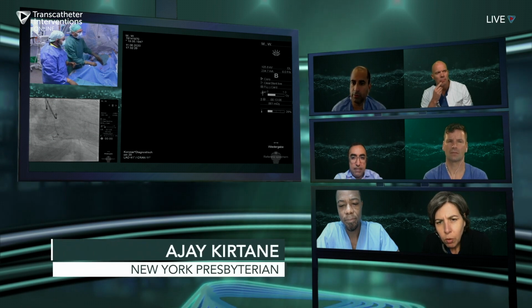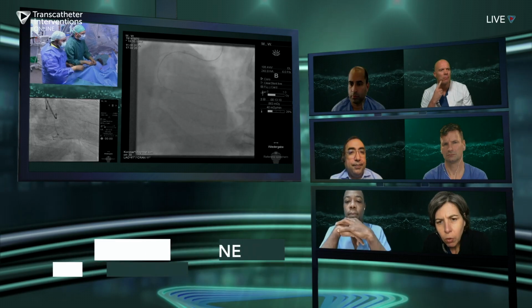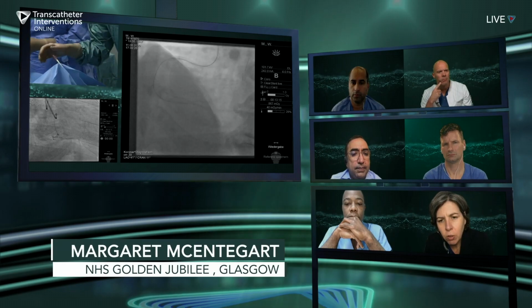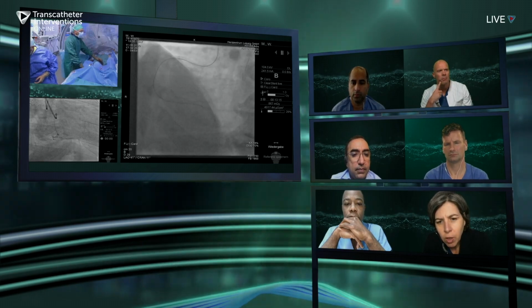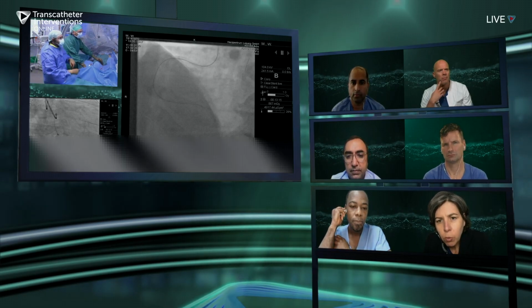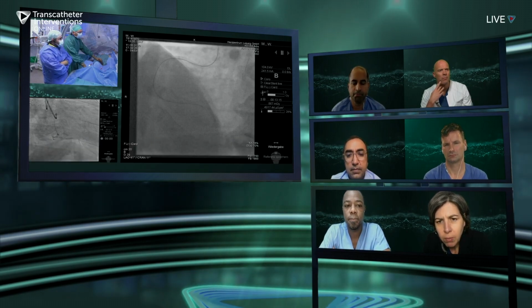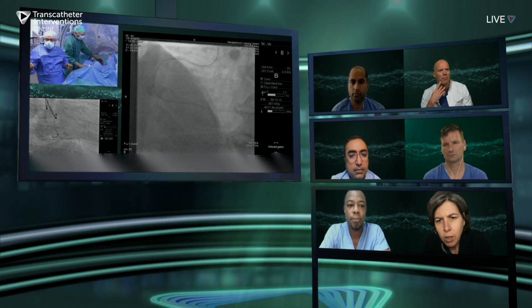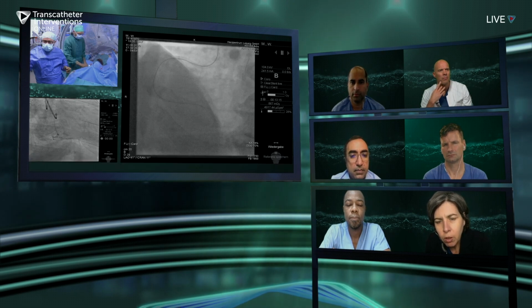Through this side lumen. If you've got good visualization of the distal target, and if you track subintimally antegrade and you can still see your distal target clearly with a retrograde injection, then sometimes I've done it with the Gaia 2 or 3, just very focused puncture through, just like you would do with the Stingray. Sometimes it works, sometimes it doesn't. But your subintimal space needs to be quite tight for it to work, because otherwise you're going to puncture the subintimal tissue.